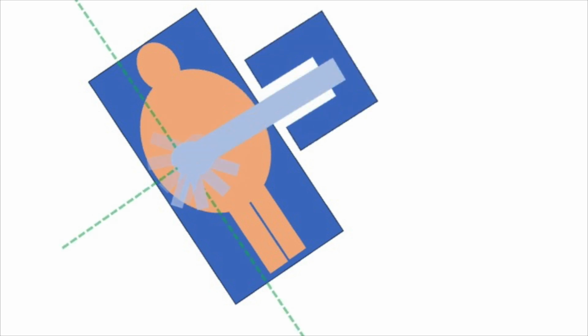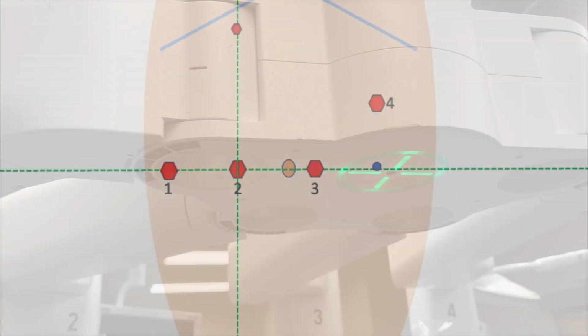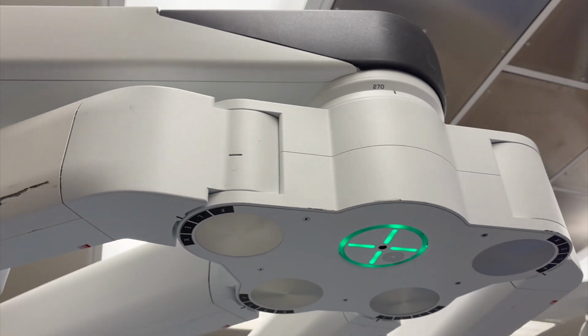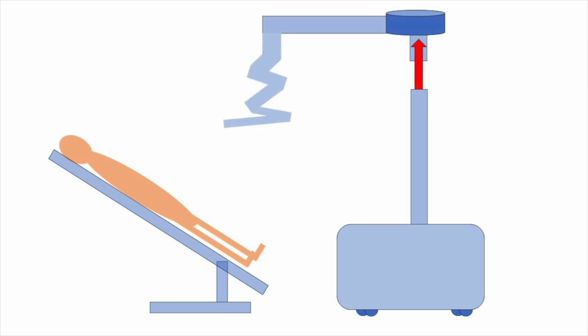The robot arm cart approaches from patient left as normal. The green laser lines should be oriented parallel and perpendicular to the table position. The laser line running the long length of the table should be positioned essentially over the patient's right midclavicular line. In order to create adequate clearance for the head of the C-arm, raise the boom to a maximum height before docking the arms.